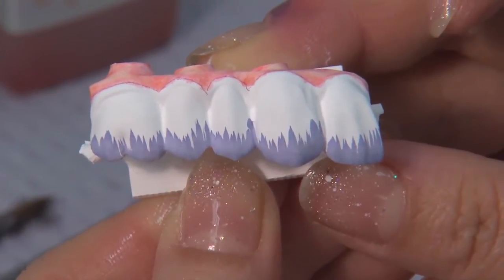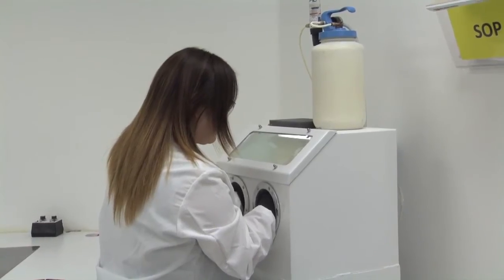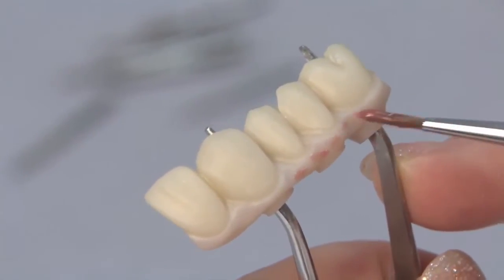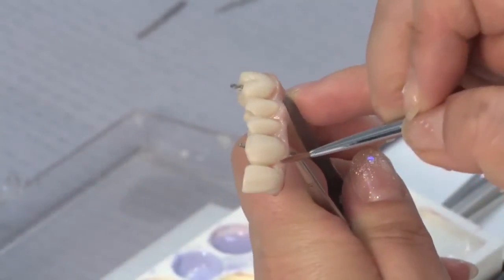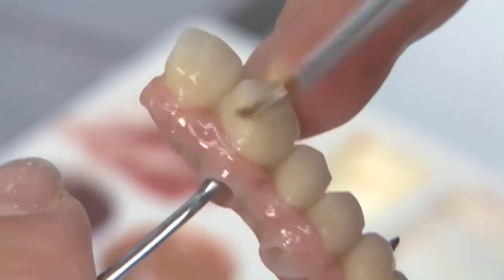Next, the partial arched implant prosthesis is centered and then sandblasted in preparation for staining. The final staining process achieves natural-looking aesthetics for the tooth and soft tissue surfaces of the monolithic zirconia implant restoration.